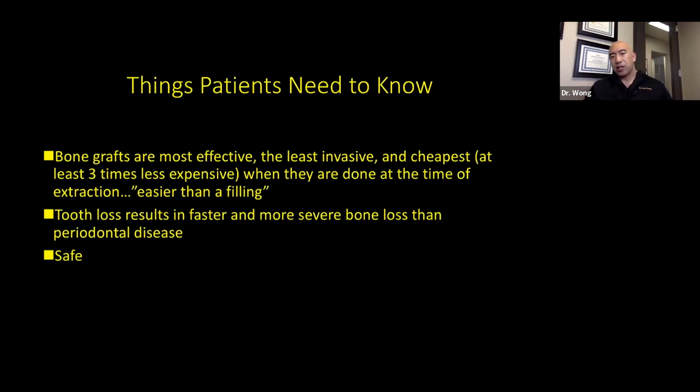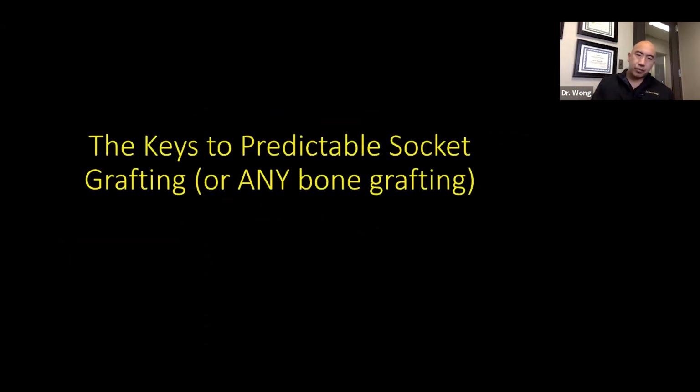But mostly what patients ask me about in the office is whether or not it's safe. And for me, whenever I'm talking to them about safety, I usually just keep a little bit of bone around in a jar, and I just show them. I just hand this to them like, look, it's just powder. It's not going to hurt you. It's freeze dried. It's been treated and sterilized and tested for hepatitis B and other antigens. That way you don't have to worry about catching a transmissible disease. And once they handle it and see it, and they're like, that's no different than just a jar of powder, that really puts their mind at ease.